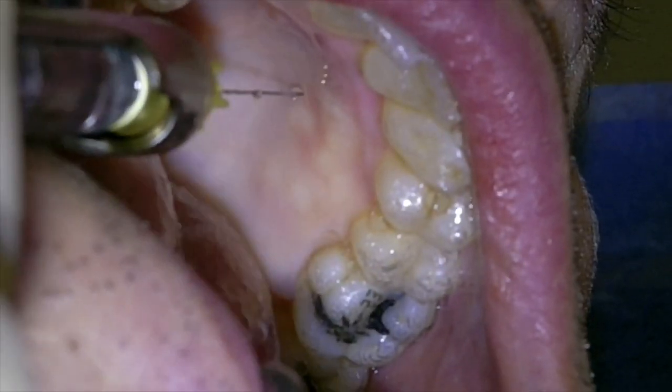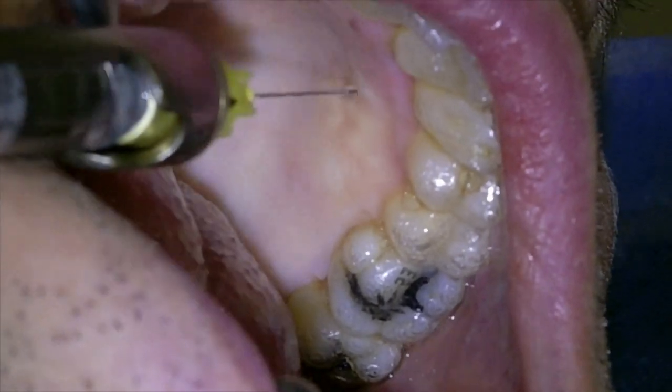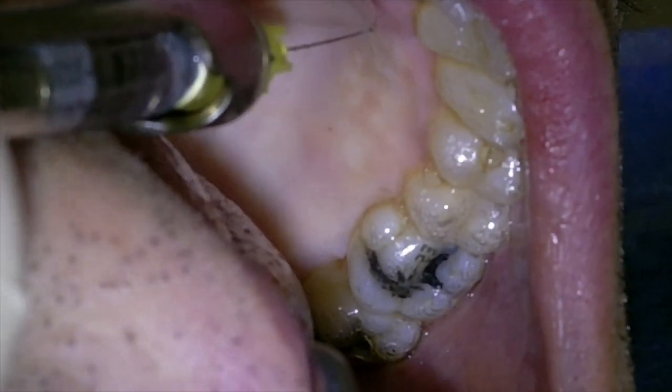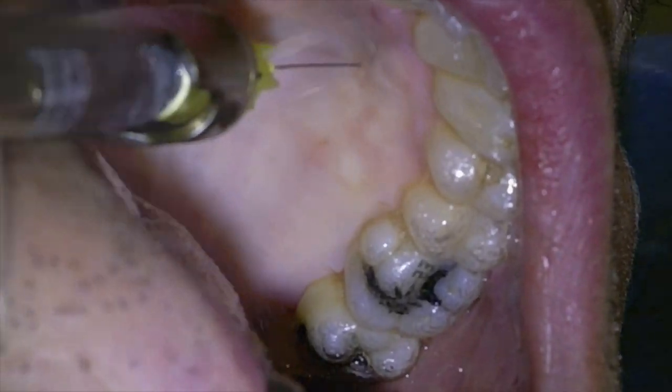Alright, so in this video we are going to learn how to do a free gingival graft. Out of this free gingival graft, we're going to be able to deepithelialize the most superficial aspect, which is the epithelium, and turn it into a connective tissue graft.